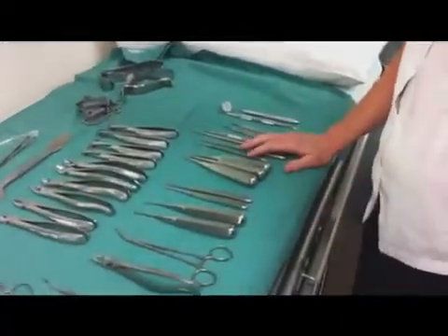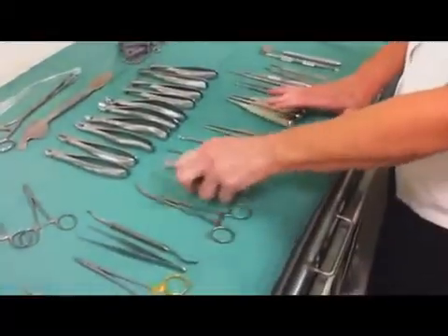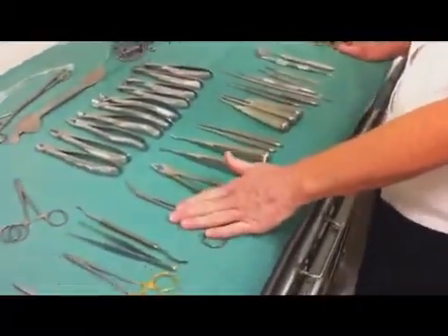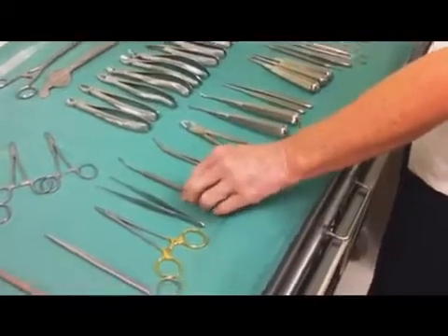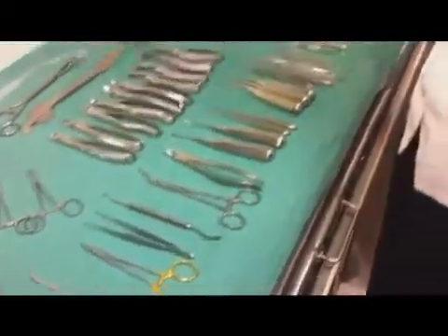Drill the bone to get the tooth out, elevate the tooth out or use forceps to pick it up, smooth it off and sew it off. So that's the way we do a surgical.